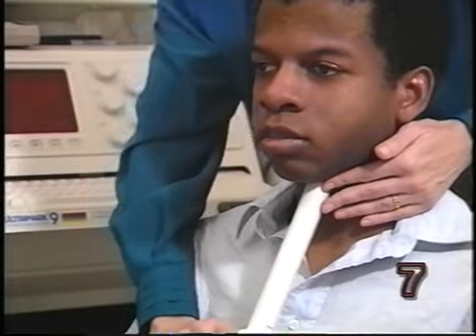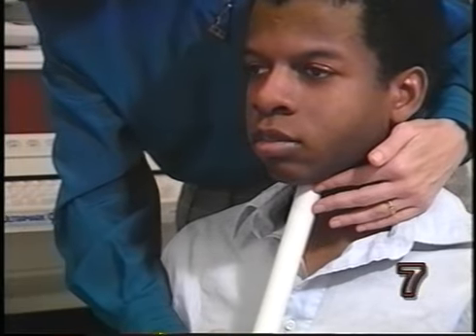Just look straight ahead. Excellent. Good. Now I want you to just say a few things. Start by saying "Allah" 3 times.